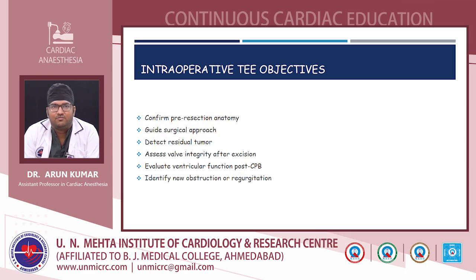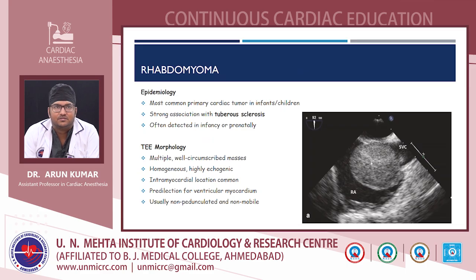So the morphology of the tumor should be assessed. We should assess the exact chamber of origin, attachment of the tumor to any septum or valve, such as the mitral or tricuspid valves, and also we should assess the size. If 3D is available, we can also assess the extent and number of lesions, single versus multiple, and the mobility of the tumor, whether it is pedunculated or sessile, and also the relation to outflow tracts. All these should be assessed.